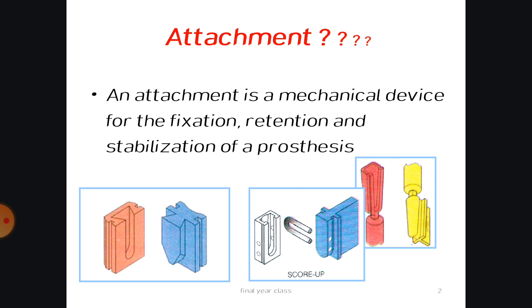But in the present scenario, many of the patients are opting for attachment retained denture. So it is mandatory that you know the different aspects of attachment retained denture. That is why this topic is relevant for today's interactive session.